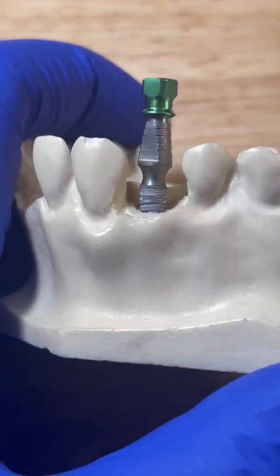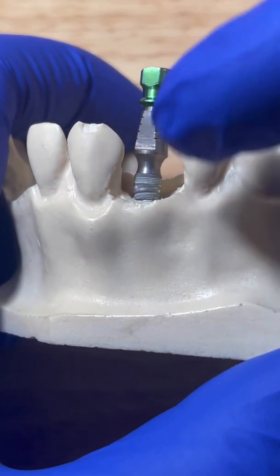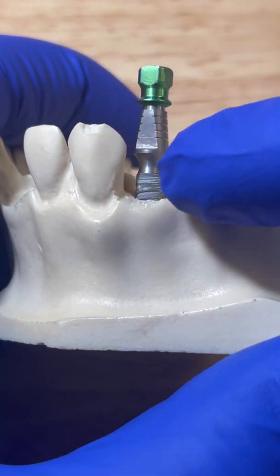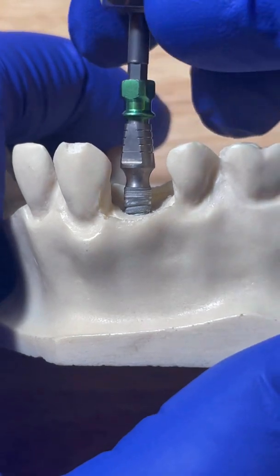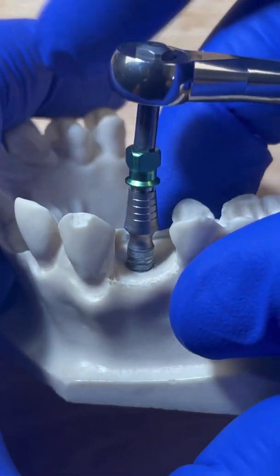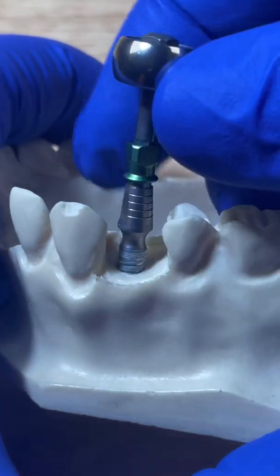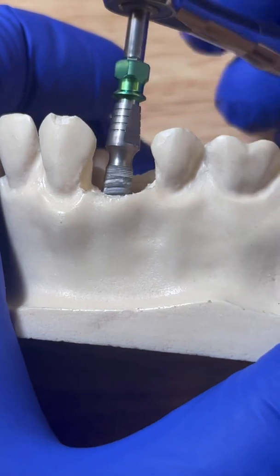So here's what I would do. Let's pretend that you're placing your implant, and once you get to this stage right here, if your implant is way too tight — like you feel like you're really having to crank down on this really hard and maybe the patient feels pain, or you're feeling like you're going to crack something — the best thing to do is actually just take this out. So we're going to go ahead and reverse our implant out.